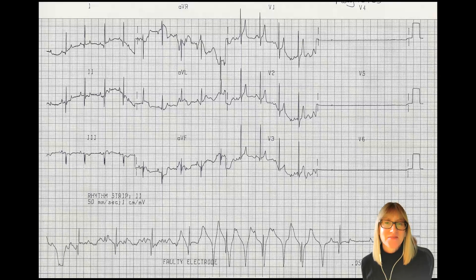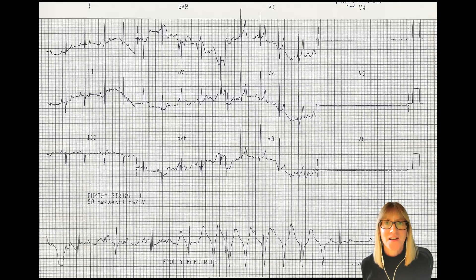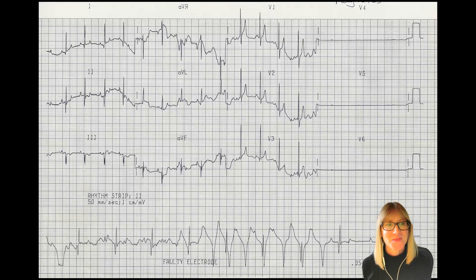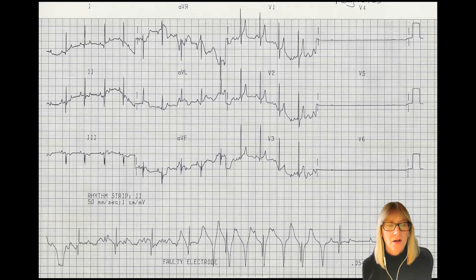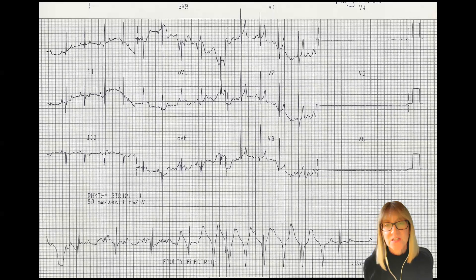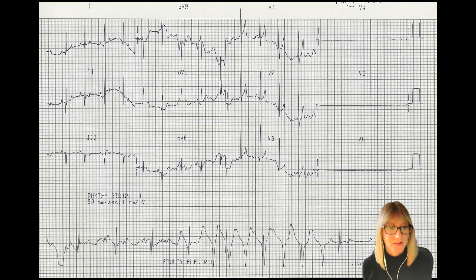Hi everyone. Today on QRS TV, we're going to look at this ECG tracing from a dog. This is definitely one from the archives — I don't even recall the signalment beyond species, so I know it's a dog. We have a nine-lead ECG. The top three lines displaying those nine leads are inscribed at 25 millimeters per second, and the bottom line is a lead two rhythm strip at 50 millimeters per second, which is why it's more spread out relative to the top three lines.